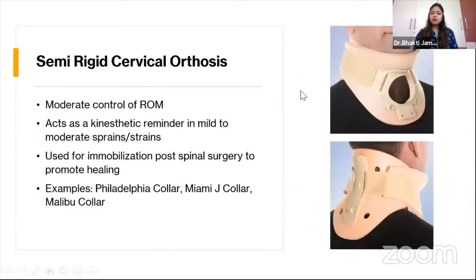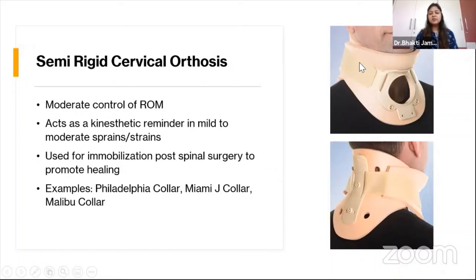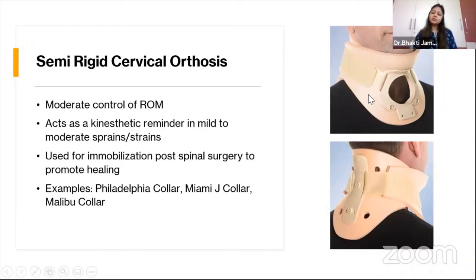The semi-rigid cervical orthosis limits mild to moderate range of motion and acts as a kinesthetic reminder for mild to moderate sprains. It helps immobilize post-surgery to promote healing. It comes in an anterior and posterior shell attached by a velcro strap, with an anterior opening for tracheostomy to assist immobilization post-cervical surgeries. Examples include the Philadelphia collar, Miami J collar, and Malibu collar — all semi-rigid cervical orthoses.